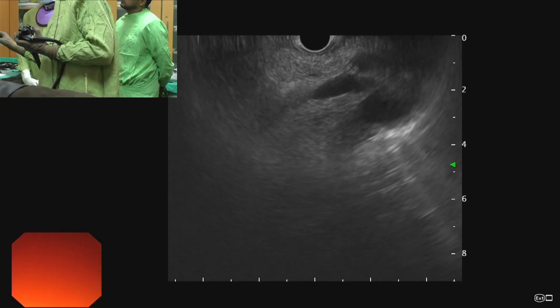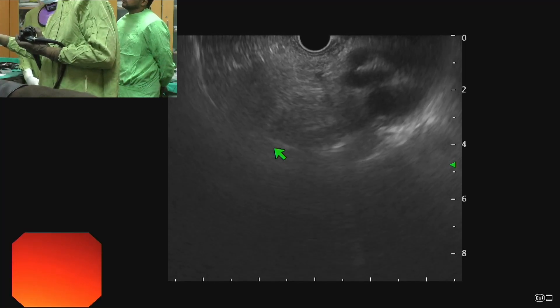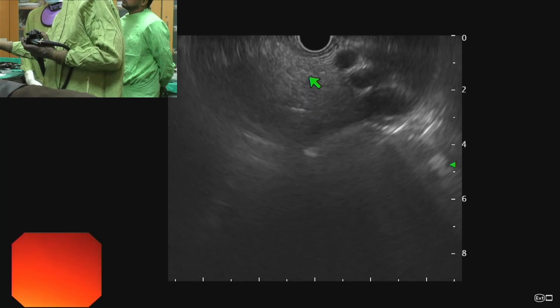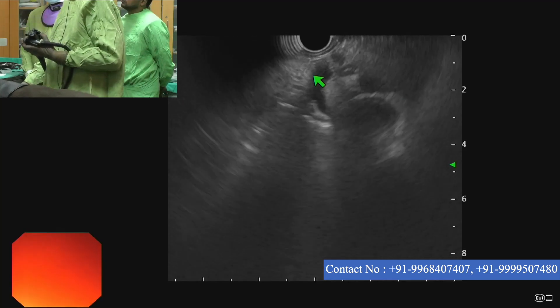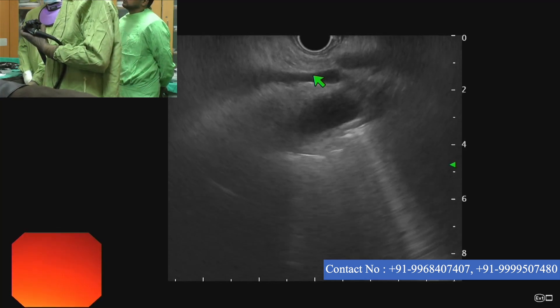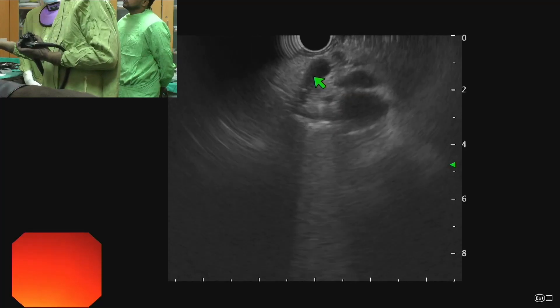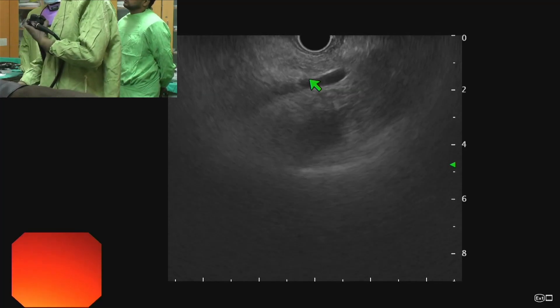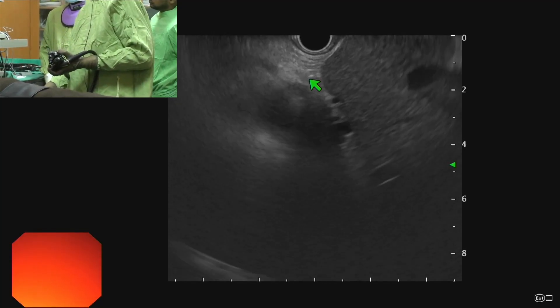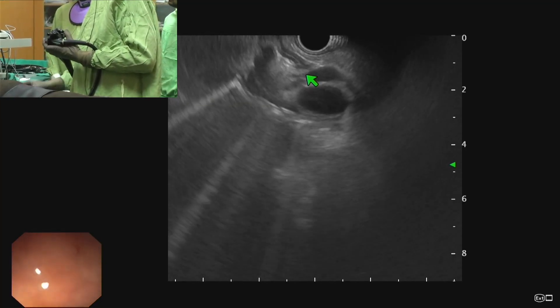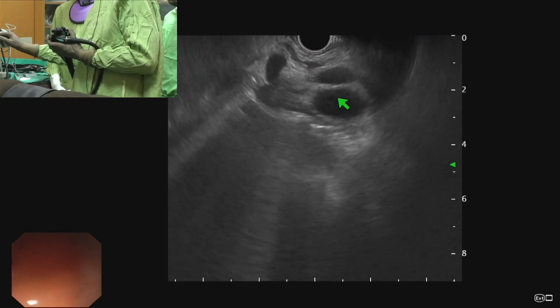Now this is the pancreas. This is the pancreas and ductus pancreaticus. This will continue as a portal vein inside the liver. This is the portal vein inside the liver. Below that we can see a dilated CBD.